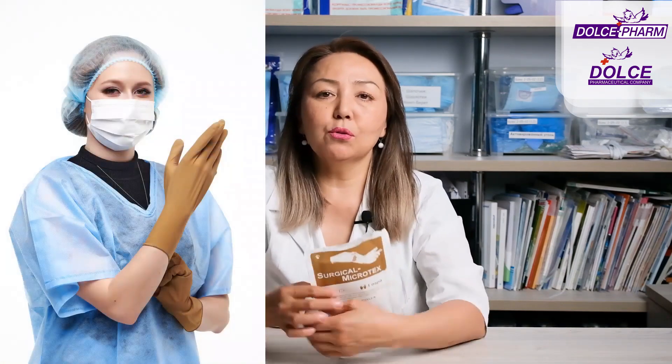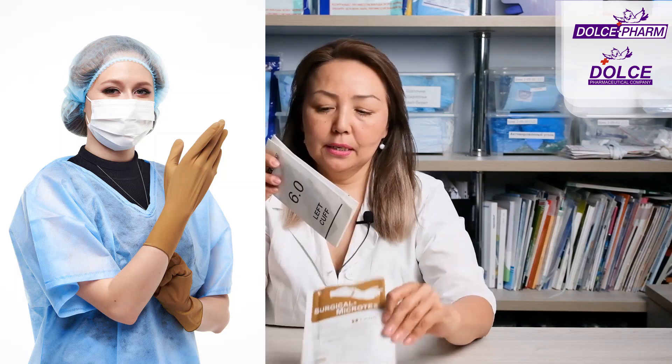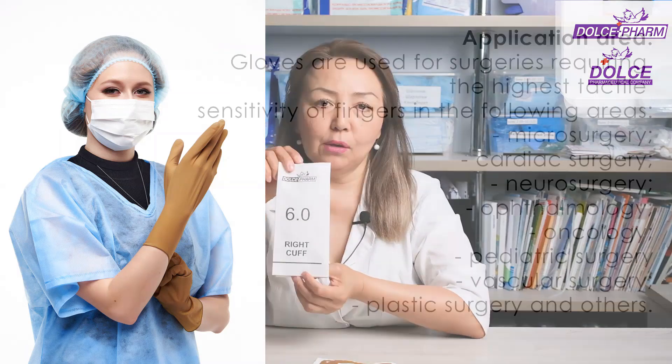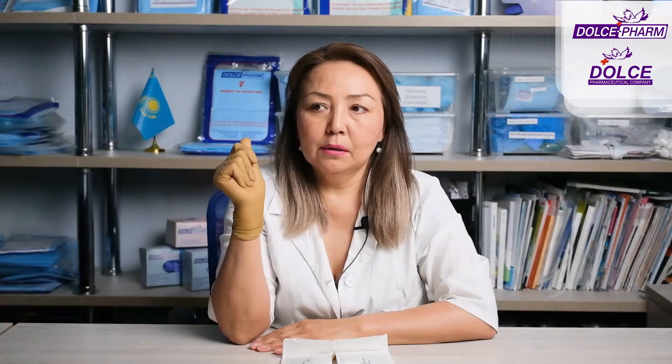The next specialized surgical gloves by Dolce are Surgical Microtex gloves. The packaging looks like this — we have pre-opened it. The packaging is for sterile gloves. The color is darker and they're not glossy but matte. This is to ensure that there's no glare when working.